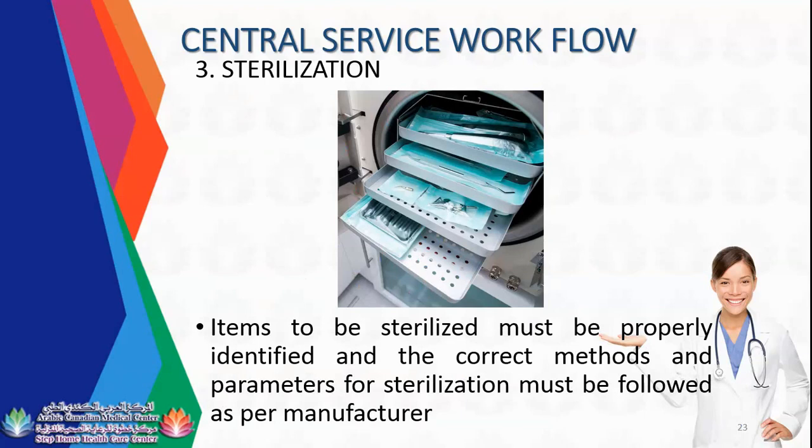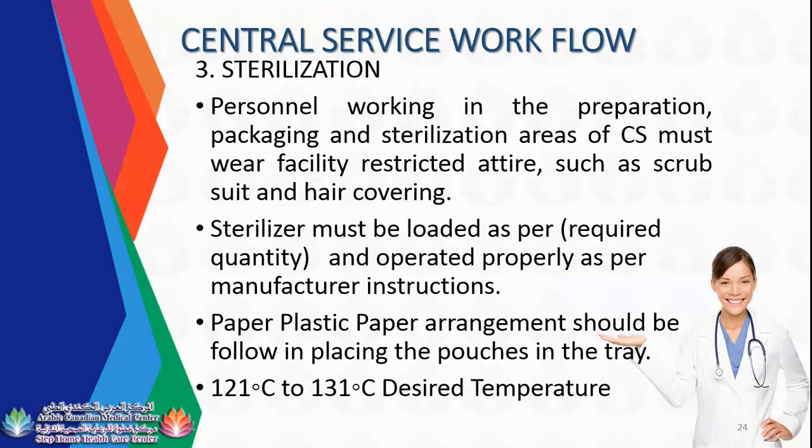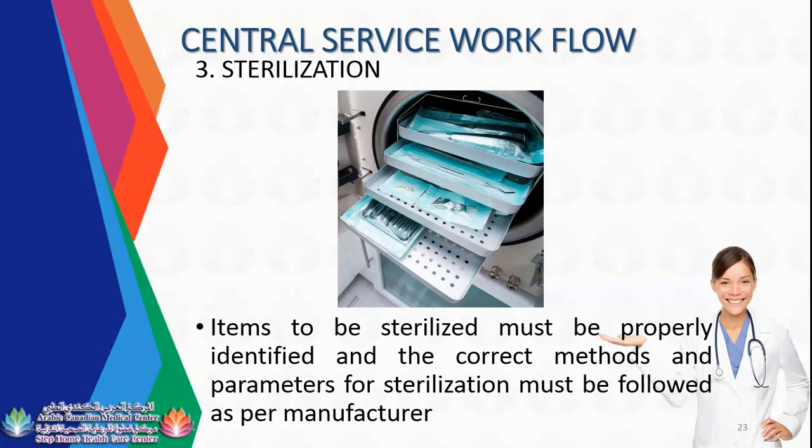Once you place a pouch in your perforated tray in the autoclave, you don't need to overcrowd or put too many instruments in one perforated tray. The reason why is that the steam cannot flow in the chamber. So it cannot penetrate all areas of the instruments, and it cannot remove the steam properly. So it will cause wet packs.